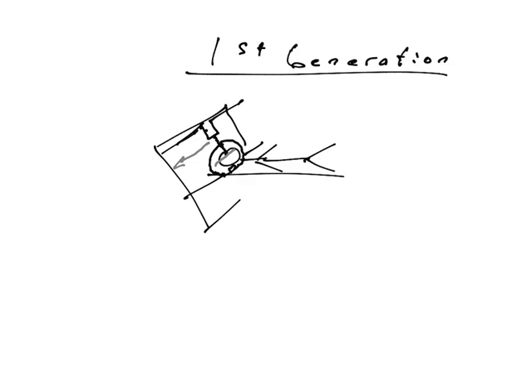Then this whole machine would rotate, the X-ray part of it, or the CT scan part of it, not the bed, would rotate by 1 degree. So now the detector's over here, sending X-rays this way, or the generator's over there, sending X-rays that way, and now it'll slide back and forth this way. And then it would rotate again, and so on, until, as before, you go a full 180 degrees.